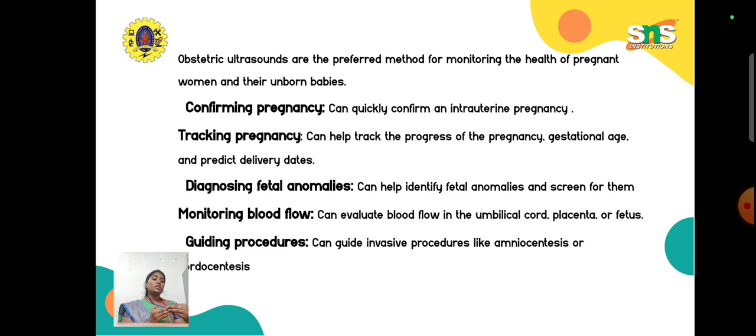We can also diagnose fetal anomalies. Anomaly refers to any malfunction or abnormality you can see in the fetus, which we can easily identify or diagnose with the help of this ultrasound. You can even monitor the blood flow, and easily evaluate the blood flow in the umbilical cord, placenta or fetus.